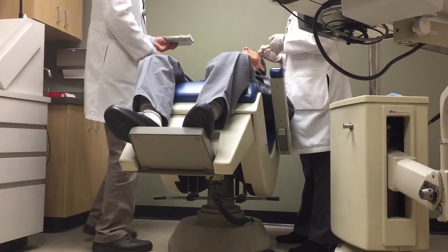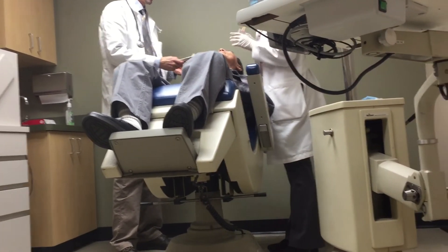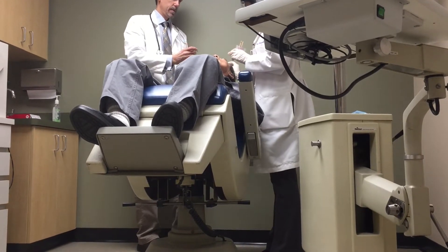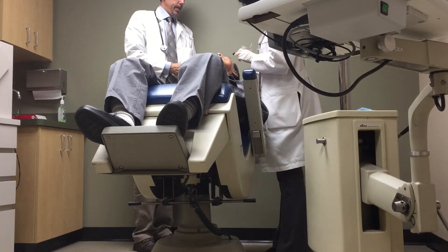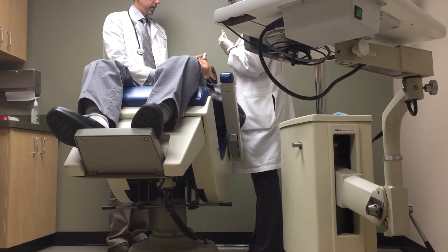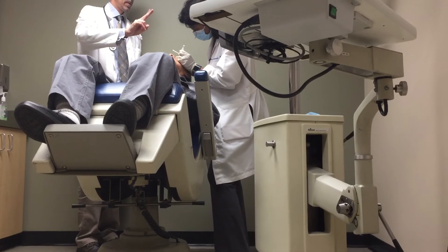And then you just bring the whole height up. Look here to the right and up. Look here. Huff a little more. Keep the rest right and up. Good, good.